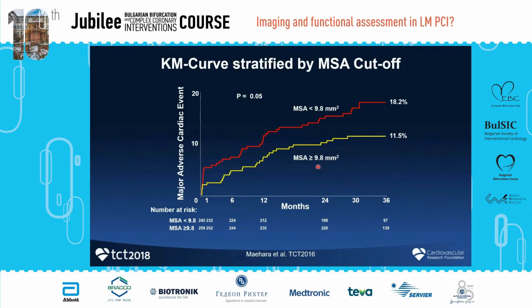When we achieve good stent expansion, we have a better outcome compared to without. And what is important is that the separation of the outcome occurs at a very early stage, because we are eliminating the mechanical issue using intravascular imaging.